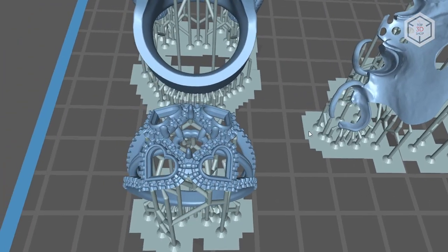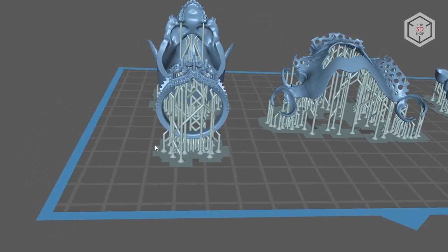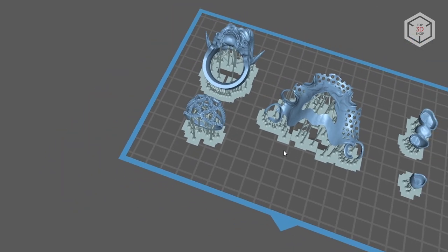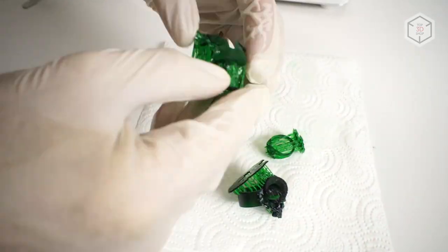And to diversify this review, we threw in a couple of rings to get some samples for jewelry applications as well. Of course, jewelry is usually not printed with dental resins and requires a higher screen resolution, but it was interesting to see how this machine would hold up in this scenario. As expected, the print went through successfully without any issues.